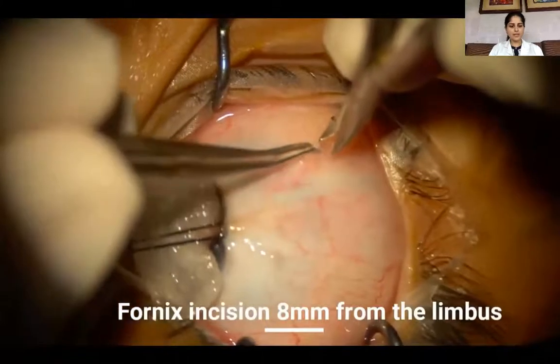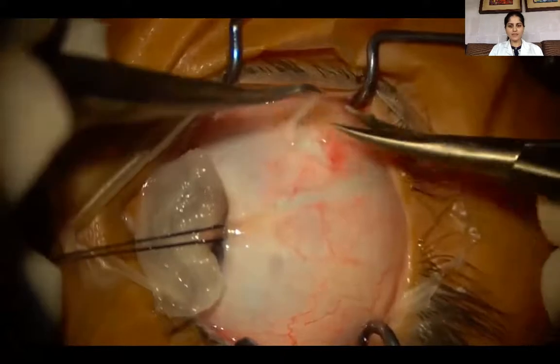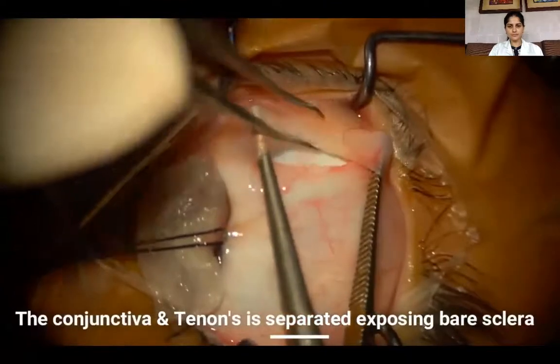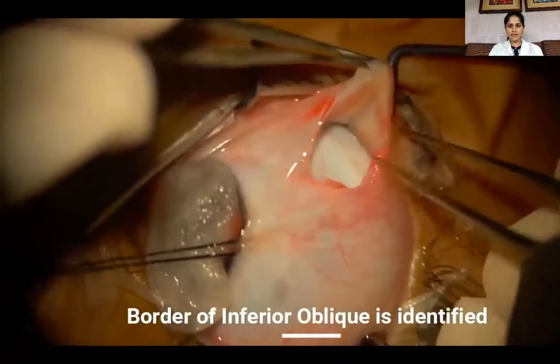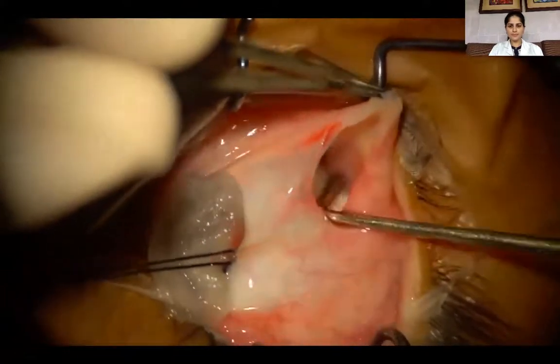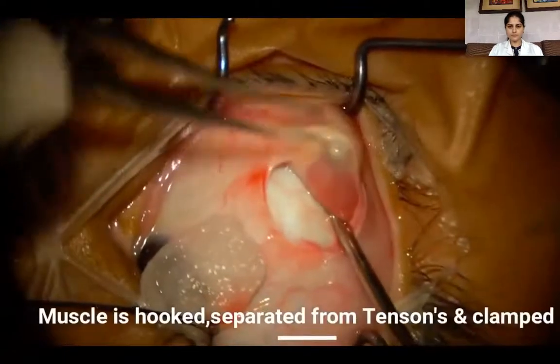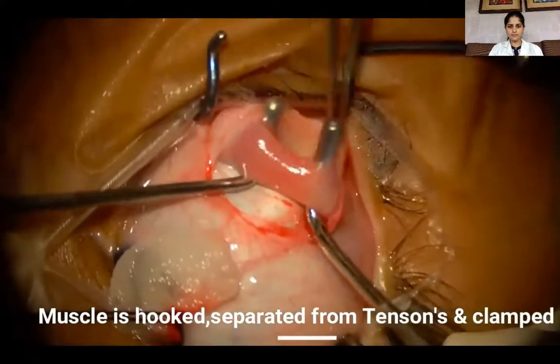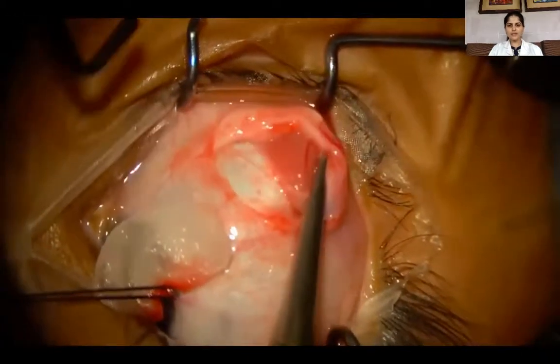A fornix incision is made 8 mm from the limbus in the inferotemporal quadrant in the conjunctiva and the Tenon's capsule. The inferior oblique muscle is identified and then hooked. It is not advisable to hook the muscle blindly.